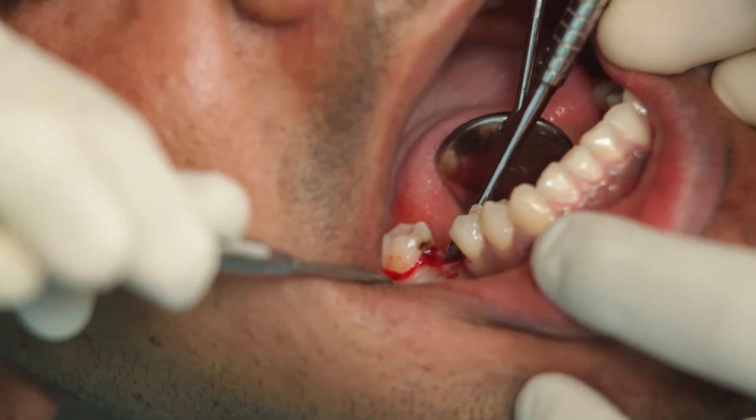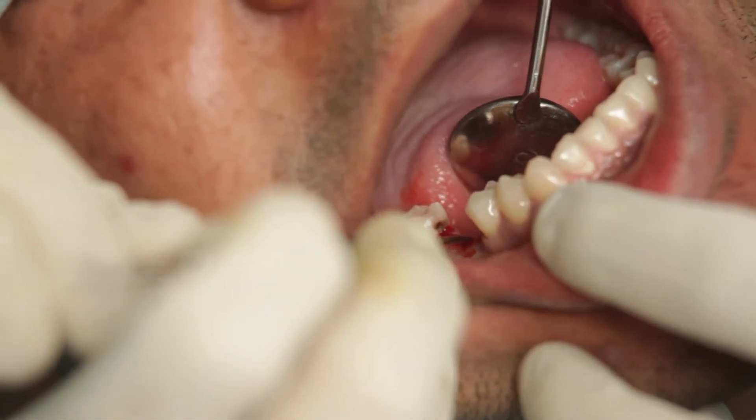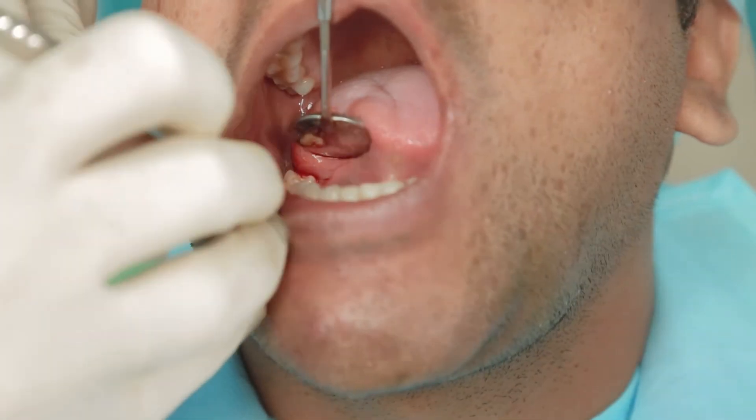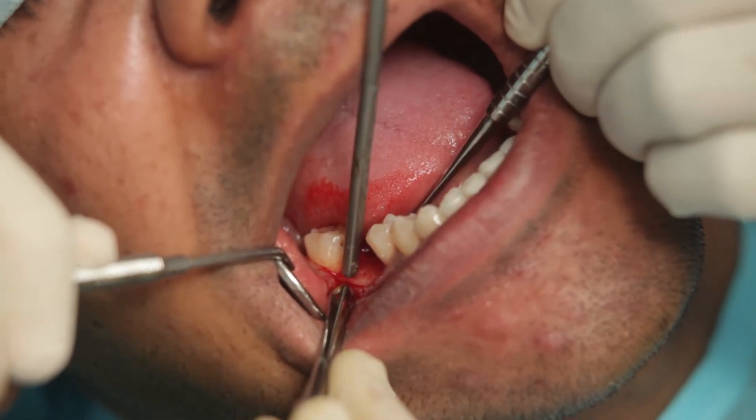I shall now use a periosteal elevator and carefully start reflecting a full thickness flap. The lingual flap is often easier to reflect than the buccal flap. There you can see the bone is nice and wide.